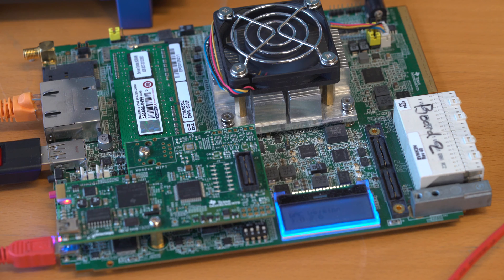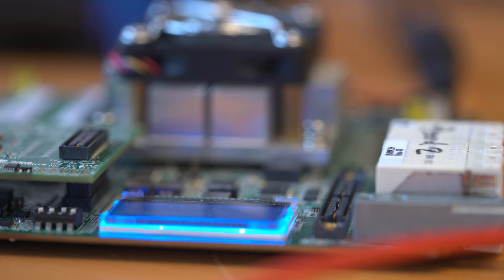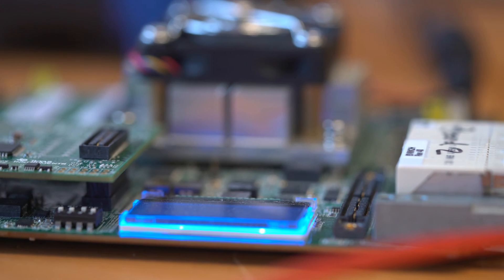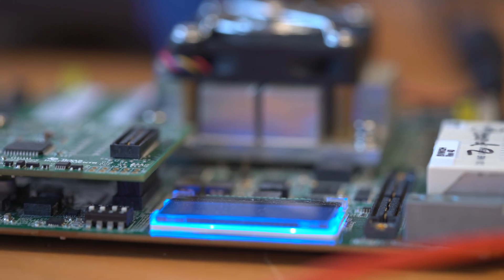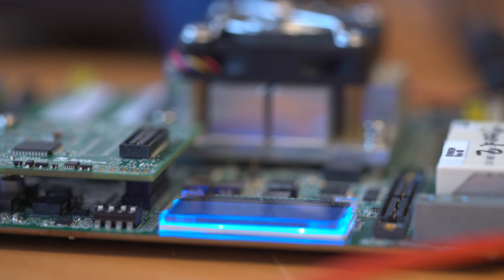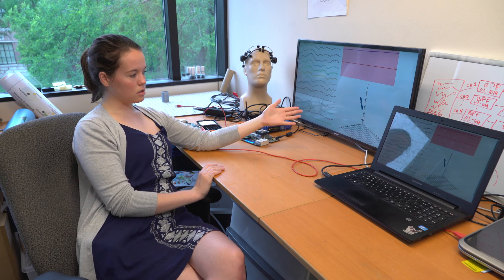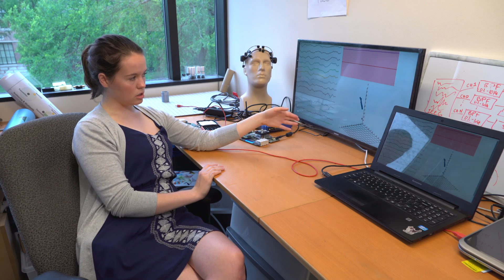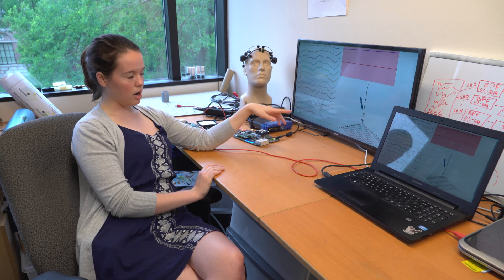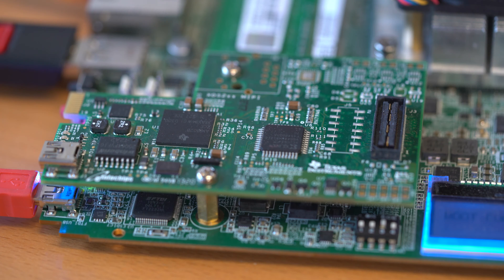Over here is the board that does all this processing. It takes in the EEG data, processes it, creates the energy statistic, extracts that, and then decides whether or not the patient is in a seizure state.